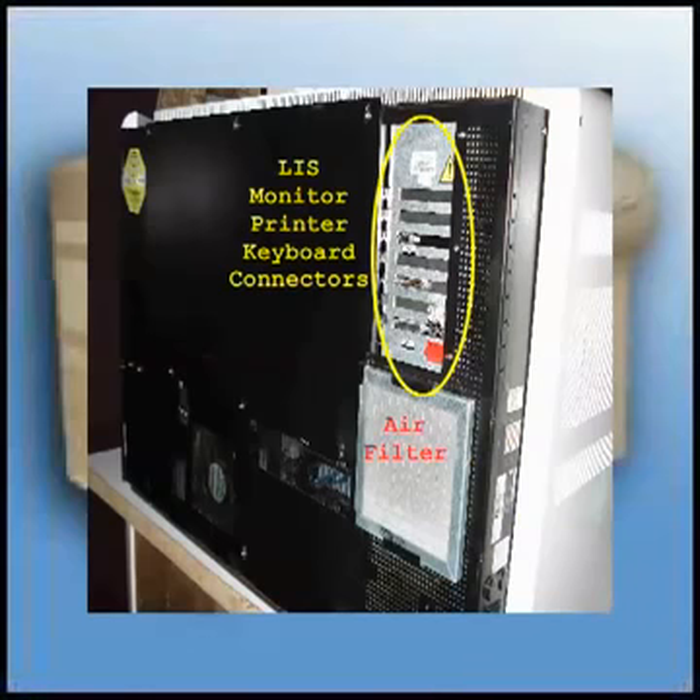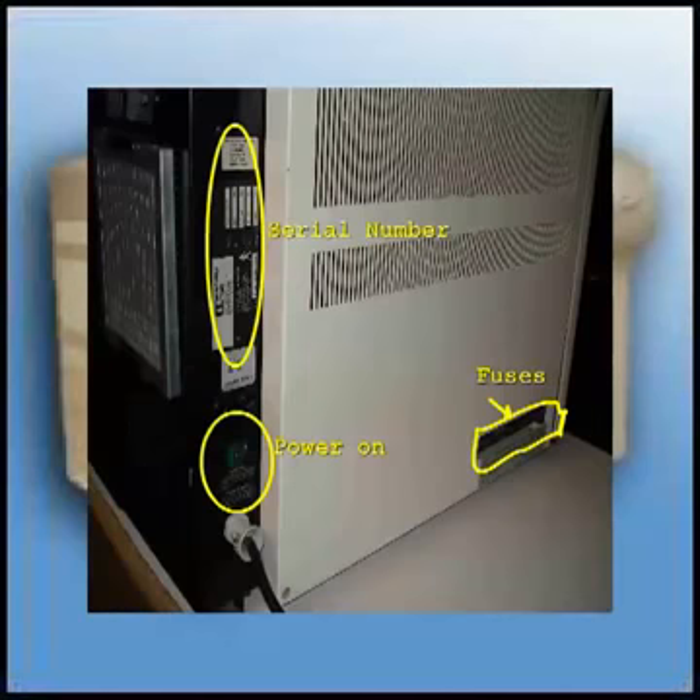Now on to the back of the unit. You have filters. On the top right, you have the connectors for the VGA monitor, the printer, and the LIS.